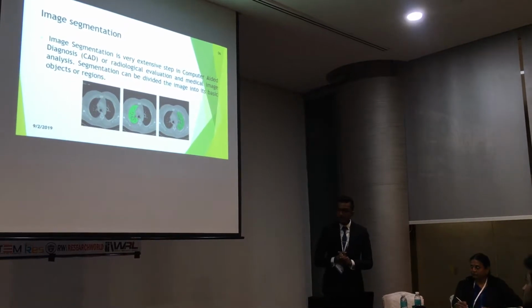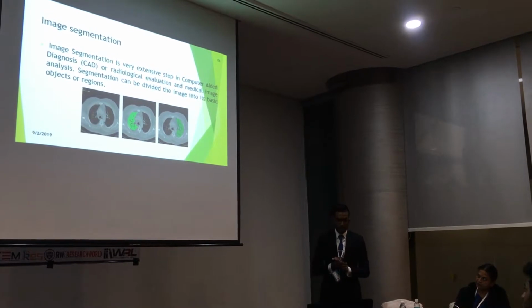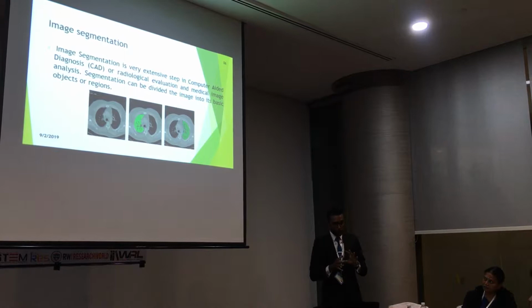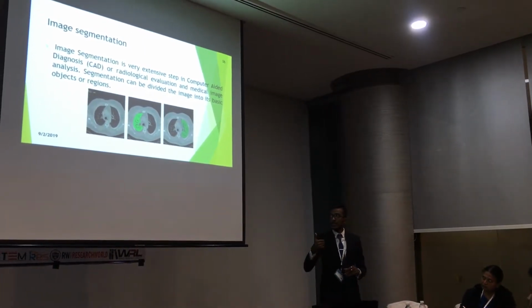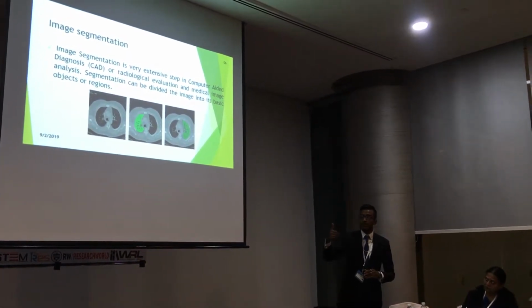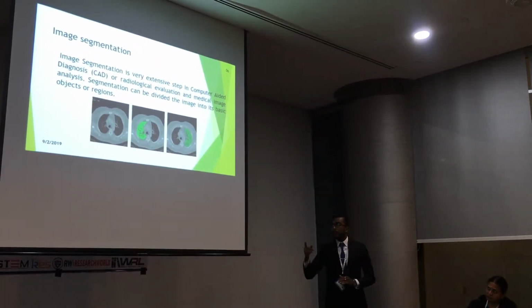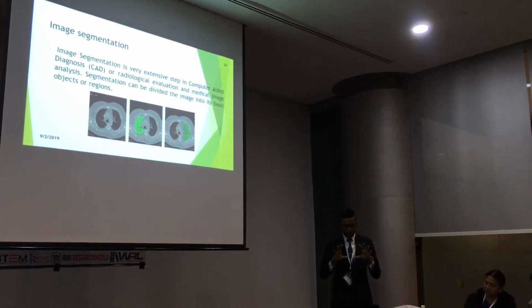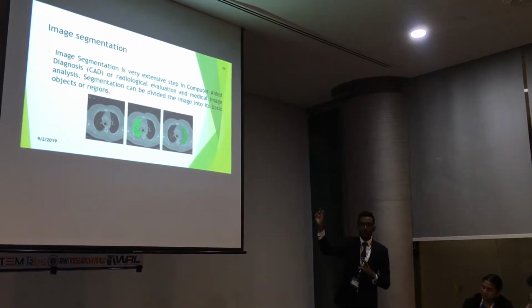Okay. Then image segmentation. It is the process of separating an image into recognizable distinct regions by grouping and organizing together neighborhood pixels based on some determined comparison criteria. Here you can see these three pictures. First one is the CT scan image before segmentation, the lung image. The second and third images are respectively the left and right lung segmentation images. The most important thing is that the CT scan can identify the cloudy surfaces on that image.